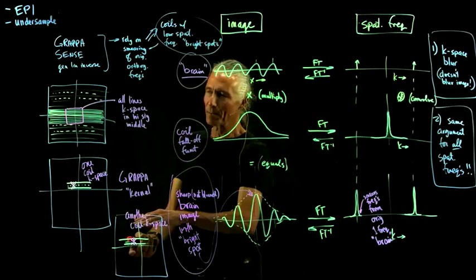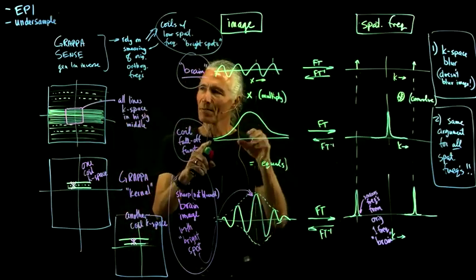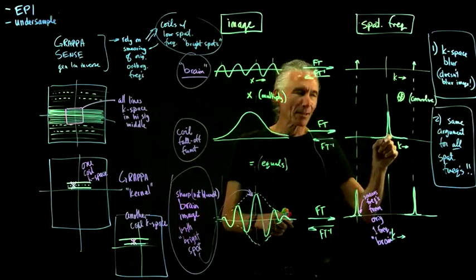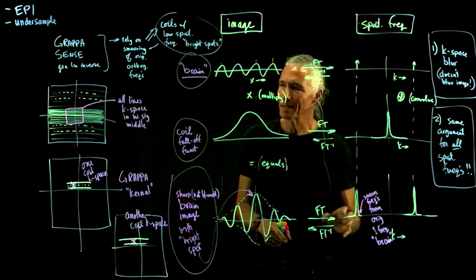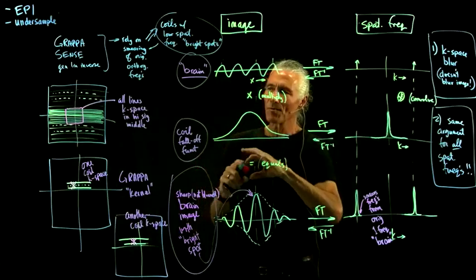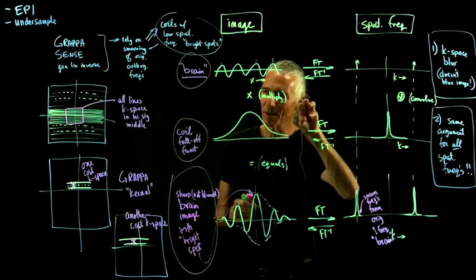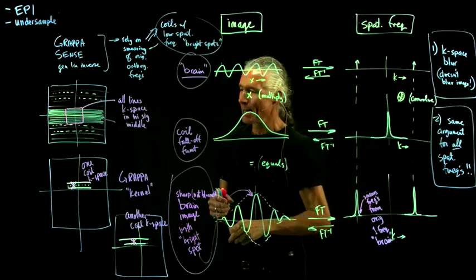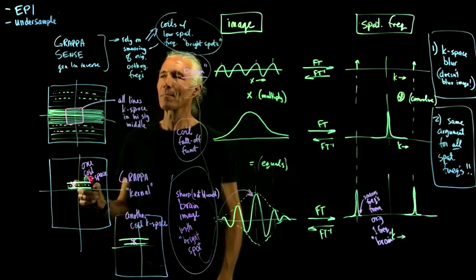The spatial frequencies would be completely orthogonal, but because of this very low spatial frequency coil fall-off function, which Fourier transforms to a teeny little Gaussian, which we then convolve with each frequency, it smears out the data. And so when you're recording with a coil with a smooth fall-off function, instead of recording a point in K-space, it's almost like you're recording a little smear in K-space that's going across K-space. And because of that, we can intelligently reconstruct missing data points.